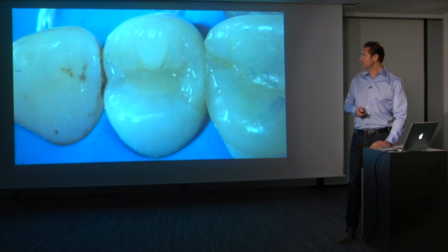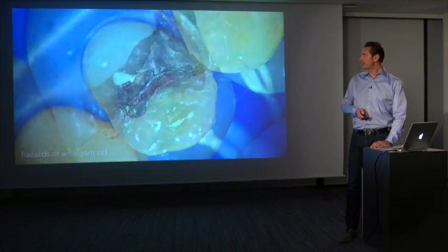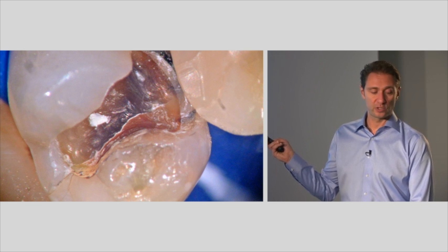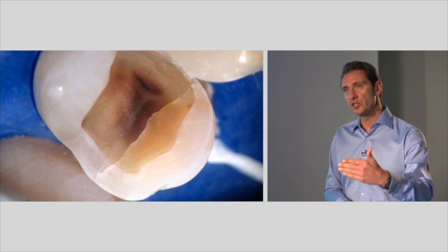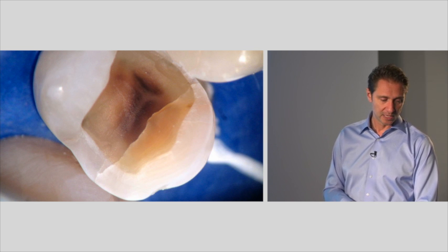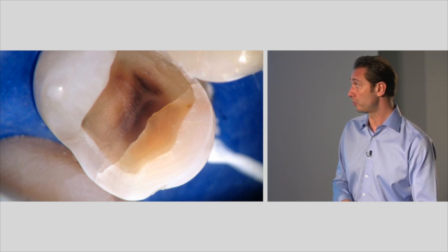and final cuspal coverage. I think another example, and it's pretty clear that we face quite some challenges. We face challenges in preventing those from originating, and we need to stop the propagation of those cracks. So this brings us, of course, to, okay, what materials should we use? What should be the approach?